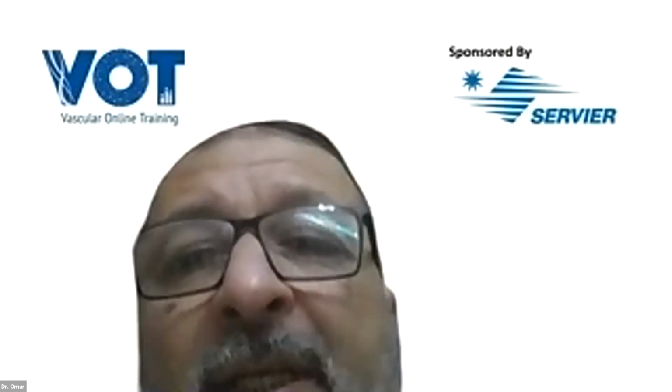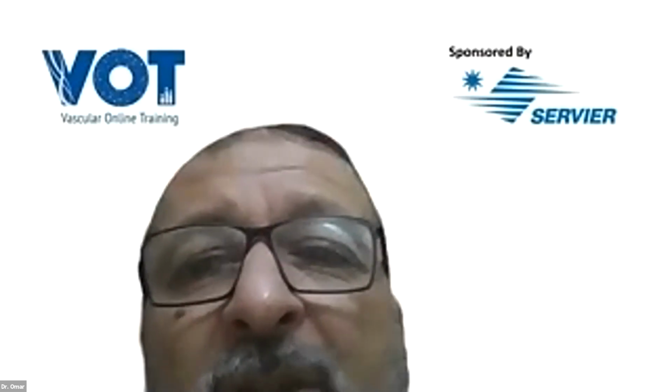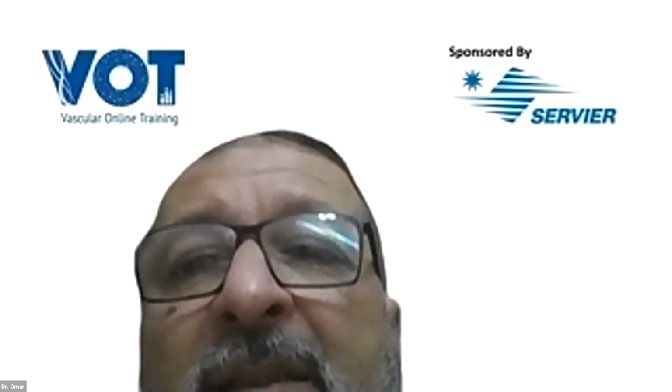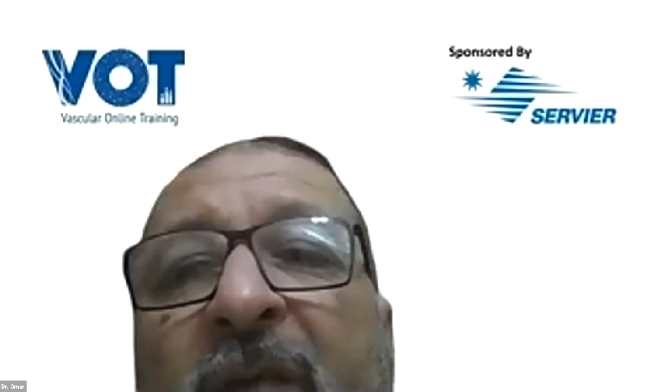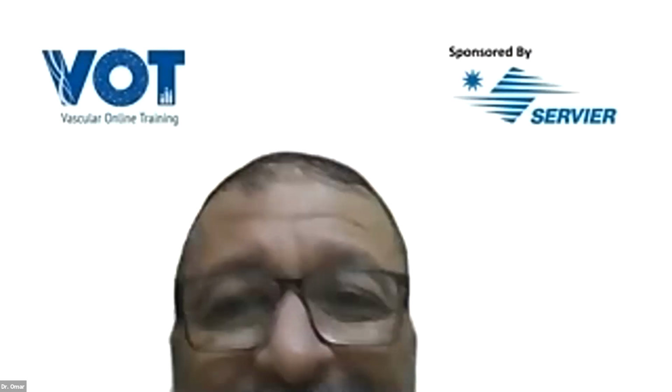Another question from Dr. Wasila Taha. Great lecture, Professor Lowell Kabnik. Again, she asks what is the difference between EHIT and ENHIT, thermal and non-thermal modality, radiofrequency or EVLA versus glue. So RF and laser, we think are the same in terms of the incidence of EHIT. We're still looking at cyanoacrylate. The mechanochemical, again, is the same for us as it would be for foam.